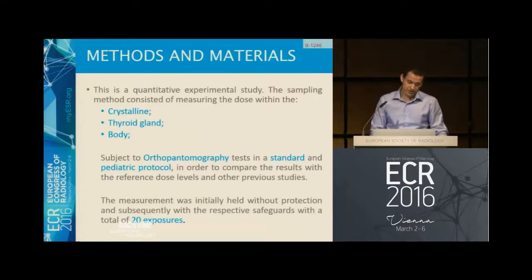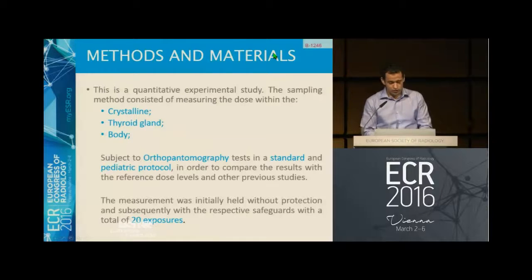So this is a quantitative experimental study. The sampling method: we measured the dose within these three body parts subject to the orthopantomography. We used the standard and the pediatric protocol in order to compare the results, and we used around 20 exposures.